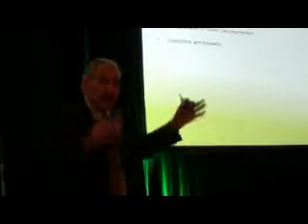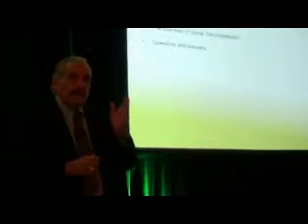You get results with it, or with other tables, if you apply these principles. And you're going to have patients and repeat patients. And you'll be able to compete with the best pain management doctors, the best surgical procedures. You'll have equal, if not better, outcomes than relying on surgical intervention that can damage the patient and injure the patient and cause repeat surgery.